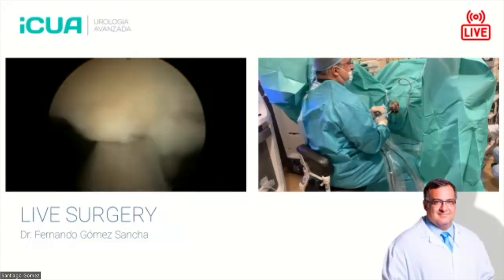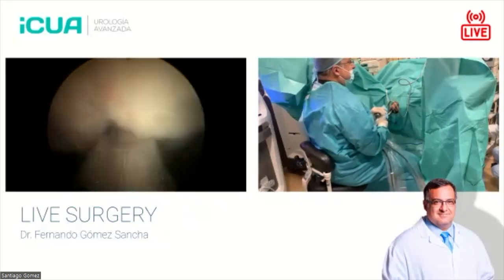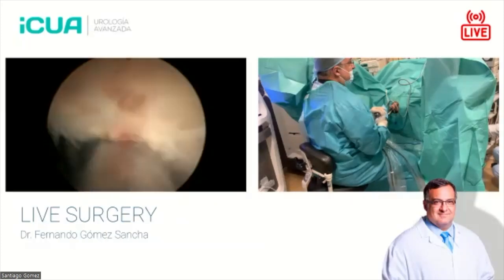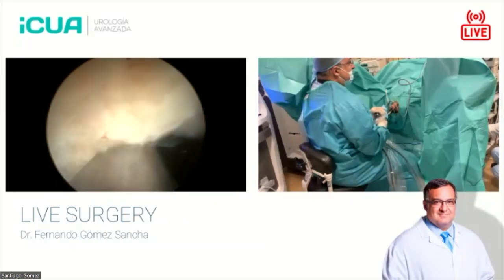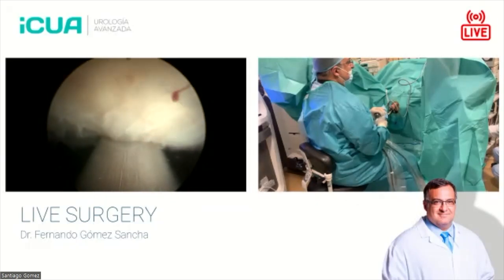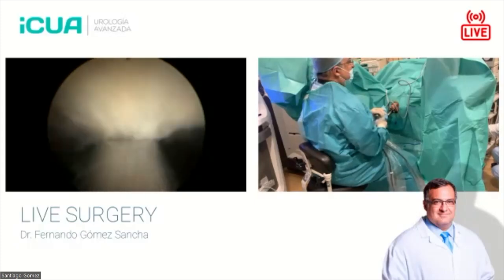You must make sure that your team is helping you because you have your eyes totally stuck in the screen. You cannot look at the water unless you stop for a moment to check if there's water coming in. And you have to rely on your team.